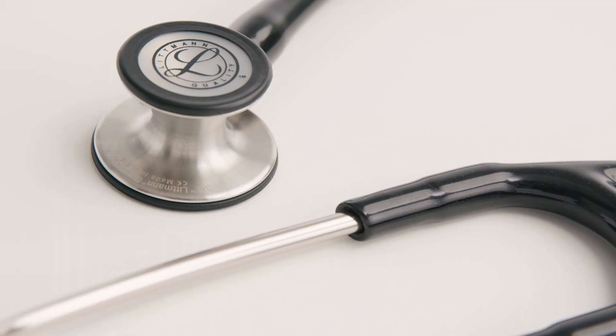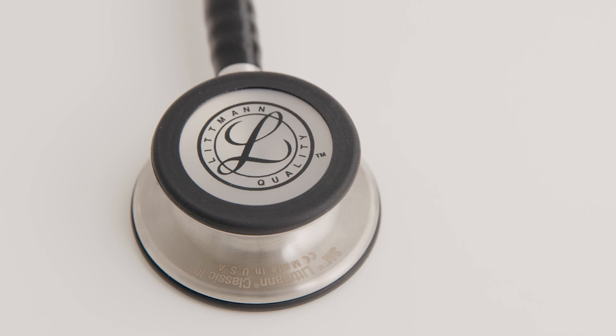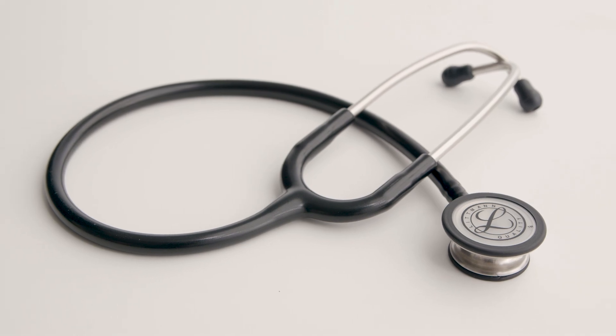The competitive advantage of Littmann stethoscopes is clear. Unlike other stethoscopes that require unscrewing and changing diaphragms and bells to hear different frequency body sounds, Littmann stethoscopes offer ease and simplicity.